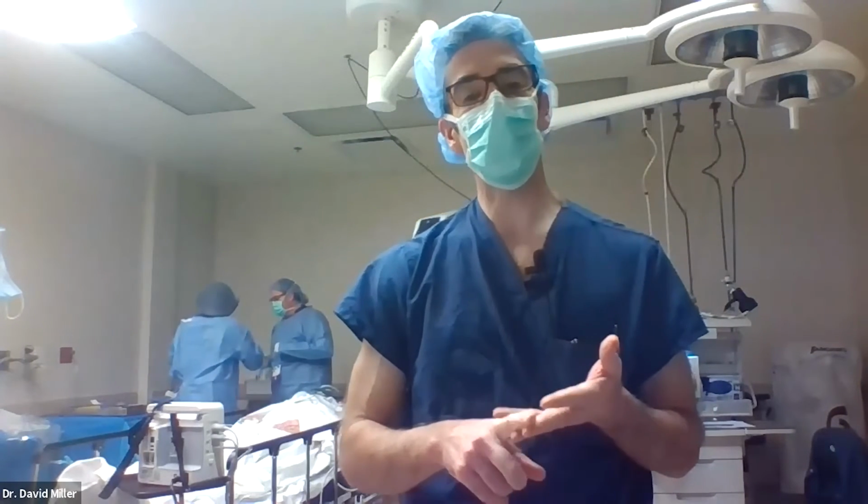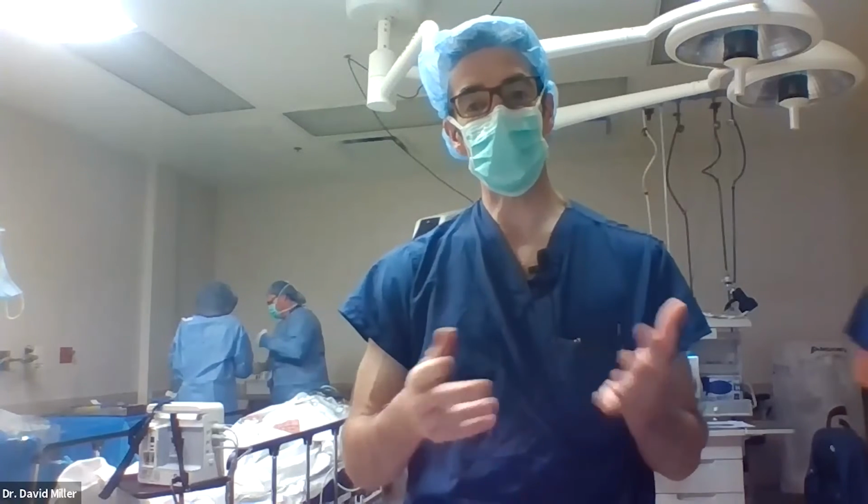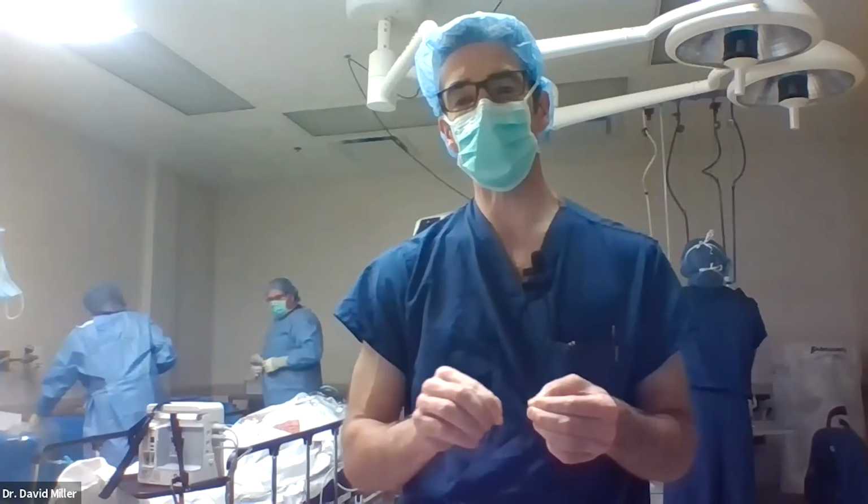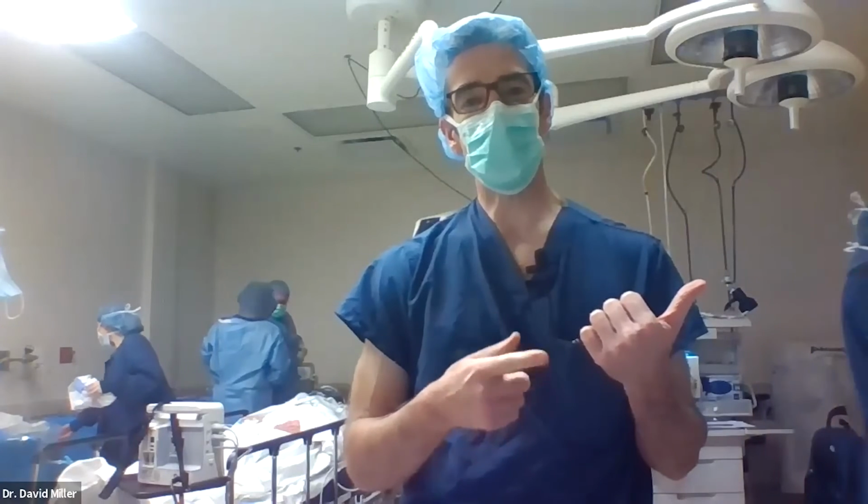And the talk of the day is the basics of vitrectomy surgery for retinal detachment repair. I think it's much more reproducible if you're not doing many of these cases to make posterior retinotomies and drain posterior. I think draining anterior, which I do in many cases, takes a higher repetition, more skill, and is not as reproducible.